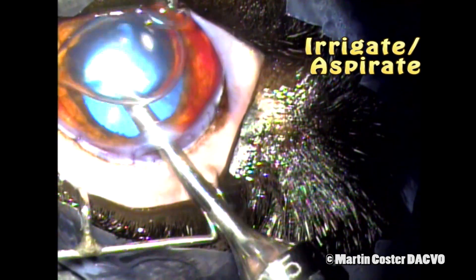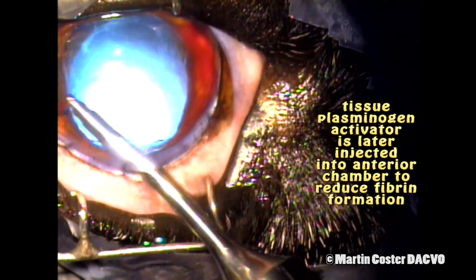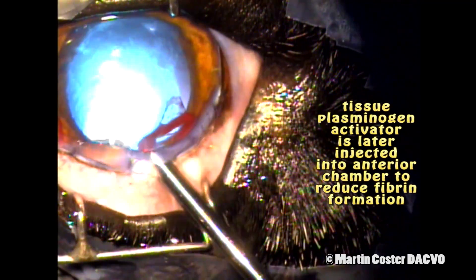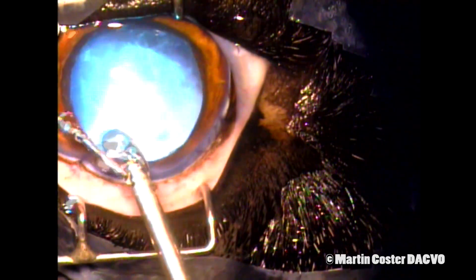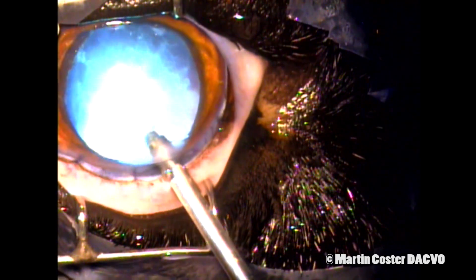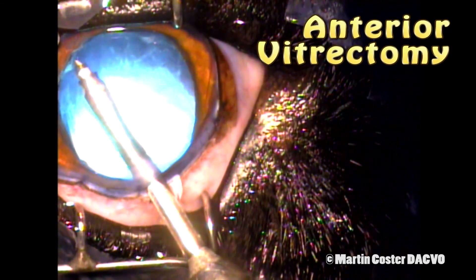Now we use irrigation aspiration to remove the hemorrhage from the globe, remove that air bubble, and make sure it's formed up. This also removes all the remaining viscoelastic agent that was put in during the lens extraction procedure. In this case, I chose to perform automated vitrectomy with this vitrector unit. This goes in and gently cuts up and extracts the vitreous from the anterior chamber — this is an anterior vitrectomy.